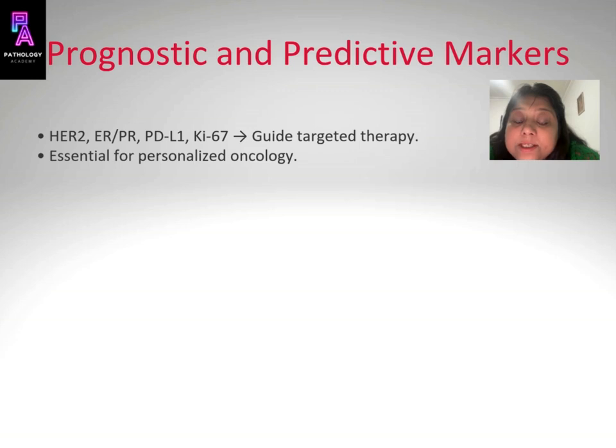IHC is the gateway to personalized oncology. Markers like HER2, ER, PR, PDL1, and Ki67 predict therapy response and prognosis, making IHC central to patient management.